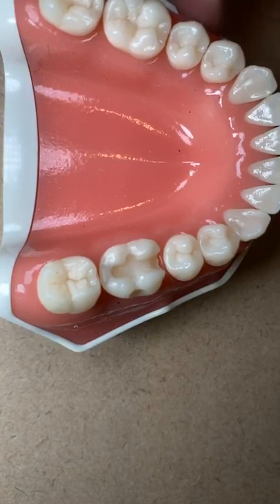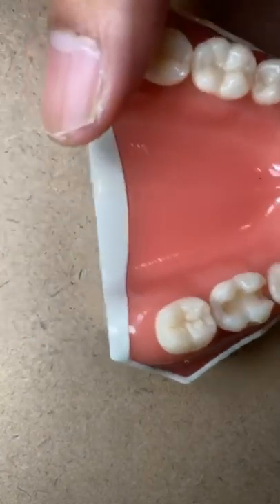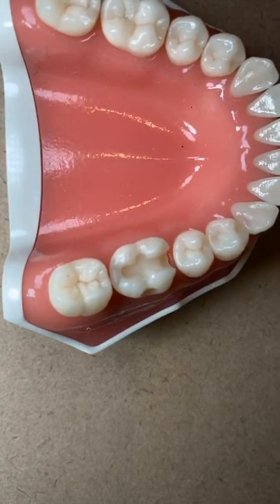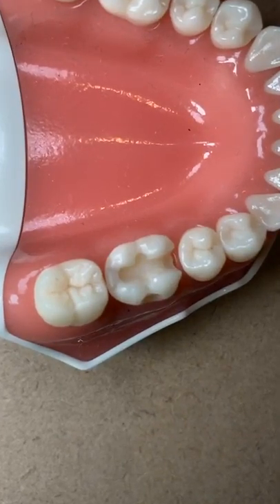And this is a class 2 MO. Yeah, class 2 MO. I don't know, how's the picture quality? Is it good enough?